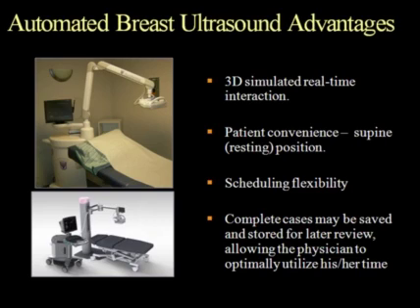And it also does give you some scheduling flexibility. You can schedule these patients for the automated breast ultrasound. Your technologist can do it. The images are stored and you can review them later. So the radiologist can be doing other things, whether they're biopsies or MRIs or reading screening mammograms.